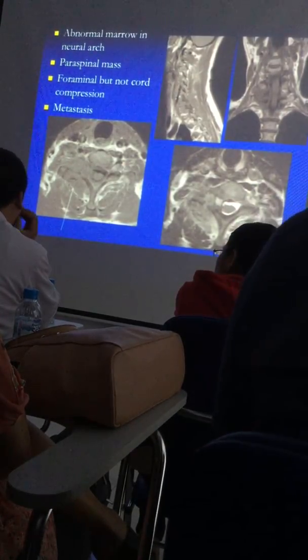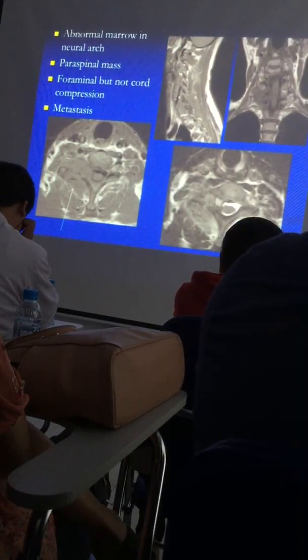So this is extradural, because here's the dura here, which is being pushed away, as the cord is being pushed away.